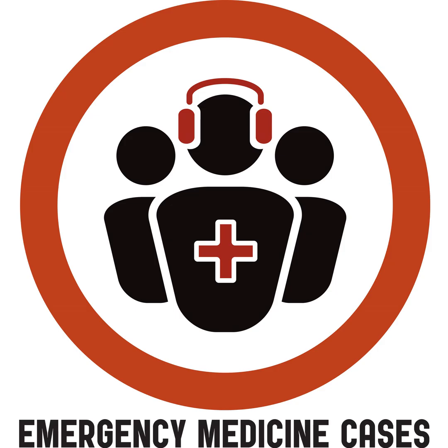having that speakerphone or walkie-talkie or baby monitor so that the team inside can communicate with the team outside. And V also stands for verify, meaning verify tube placement with end tidal CO2 and that the ETT cuff is inflated before initiating positive pressure breaths.